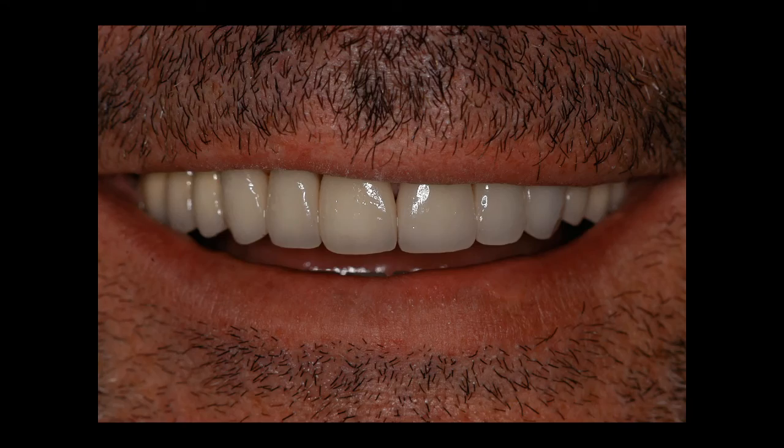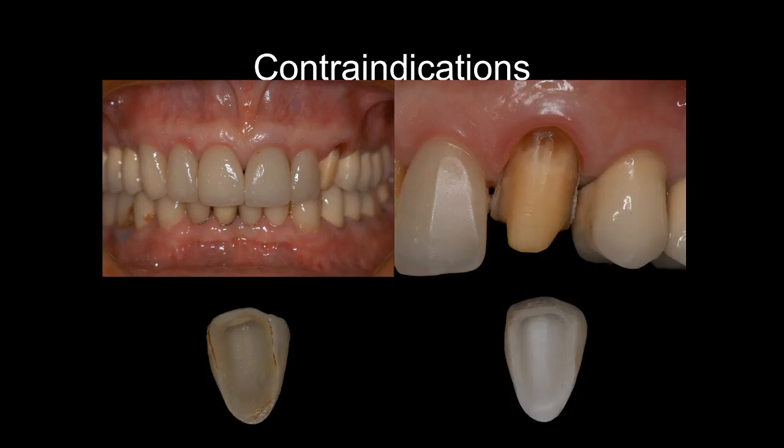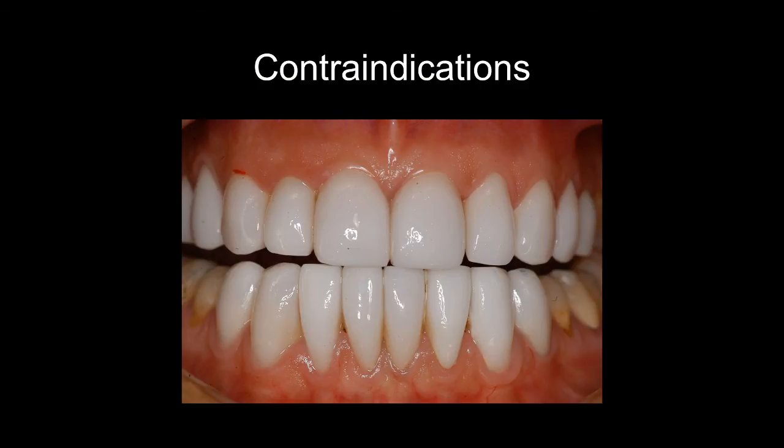It will happen sometimes that it will debond because there is not enough enamel to hold the veneer or the crown. Whether it is a feldspathic veneer or a disilicate crown, like Emax, the bonding is composite bonding, and the composite is weak on the dentine, not as strong as we would like it to be as in enamel. The contraindications of these veneers are situations like this, where really it's not only a facade.